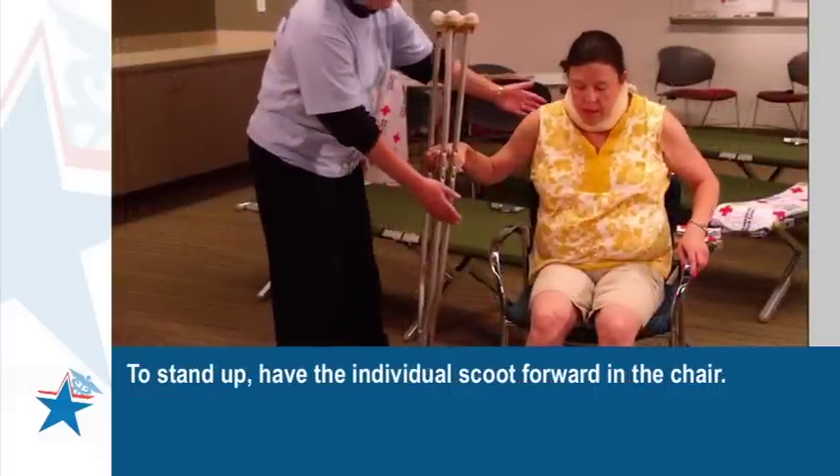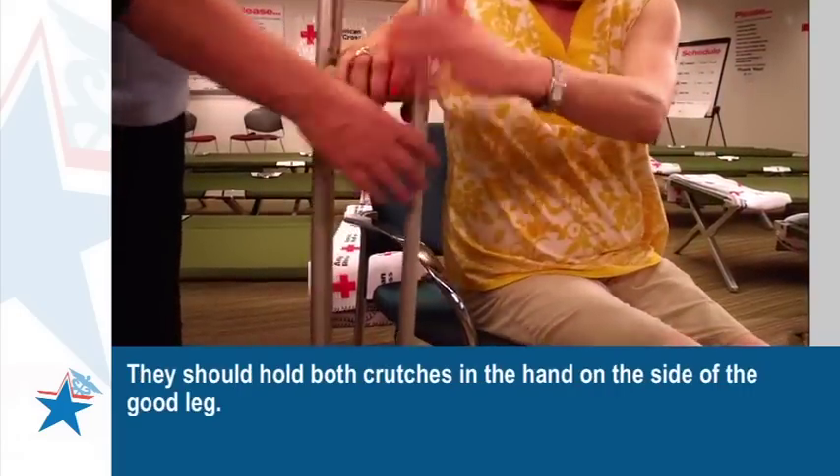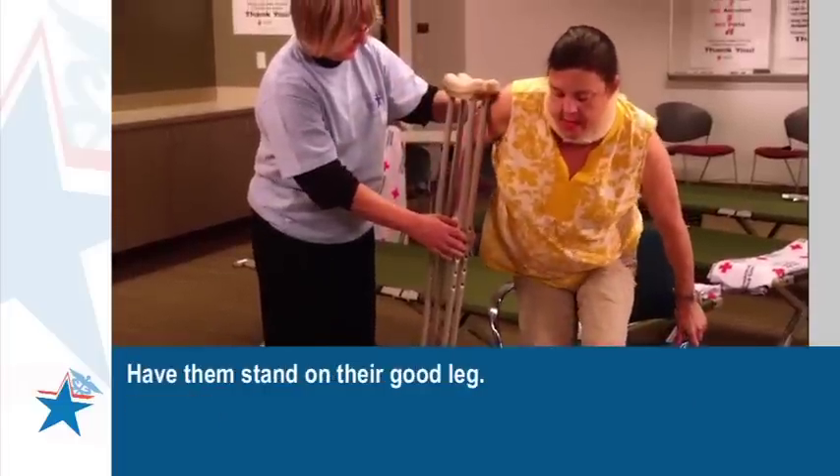To stand up, have the individual scoot forward in their chair. They should hold both crutches in the hand on the side of the good leg. Have them stand on their good leg.